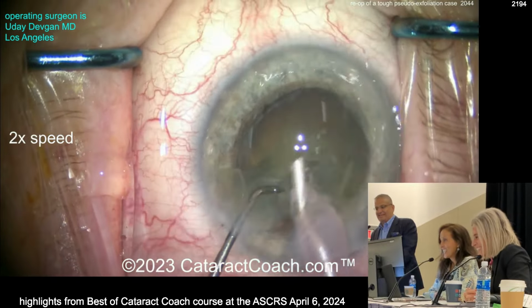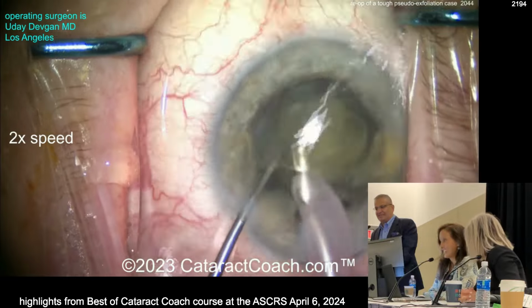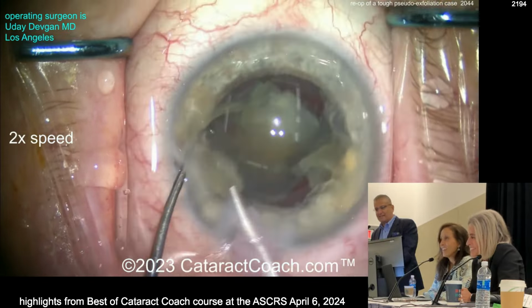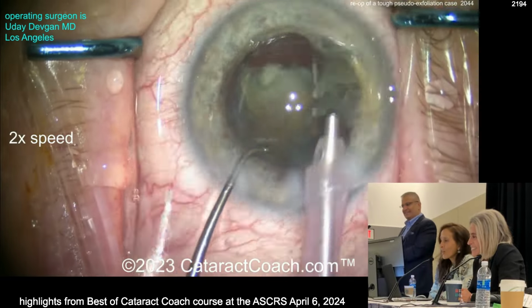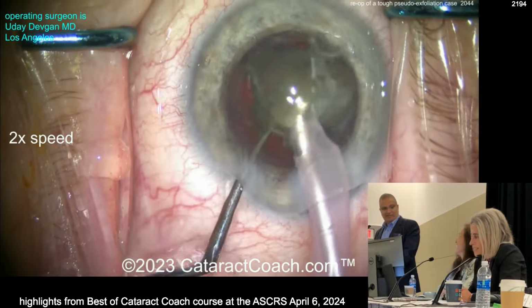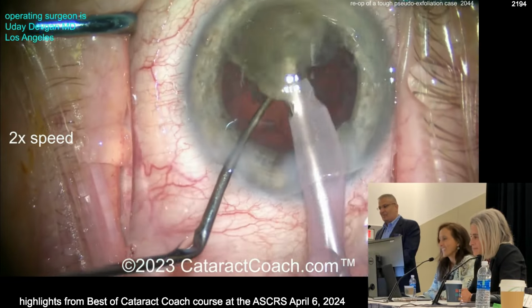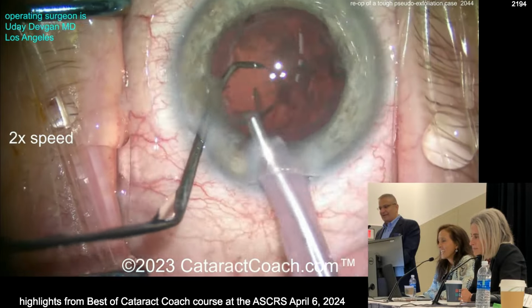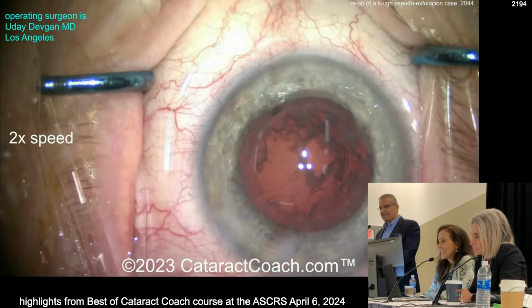So yeah, I'll chop, more chop, get this thing out. So look, there's zero stress on the bag. How good is that? Just ask the corneal endothelium. The cornea is perfectly clear the next morning. No, I'm totally joking. You know that. Perfectly clear. Phaco power modulations, beveled down, very little energy. Clean it up pretty nicely.